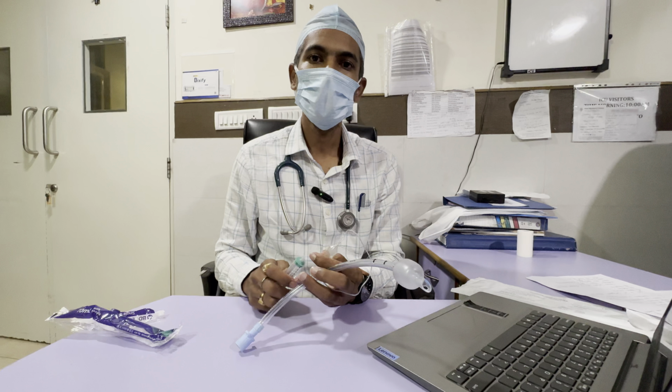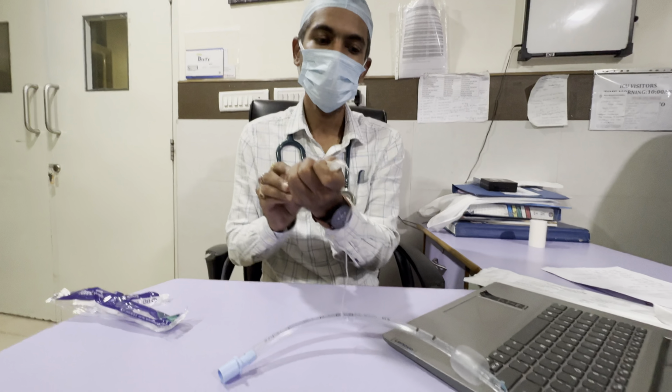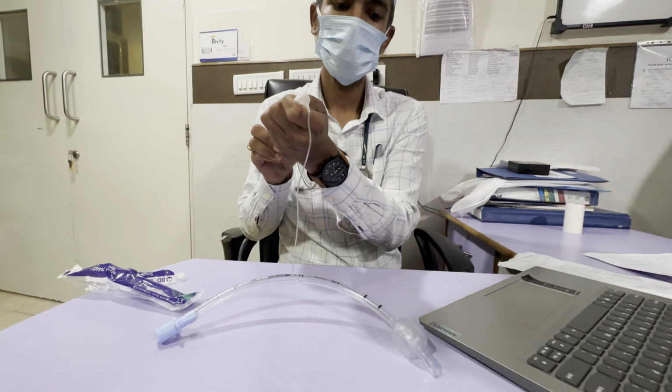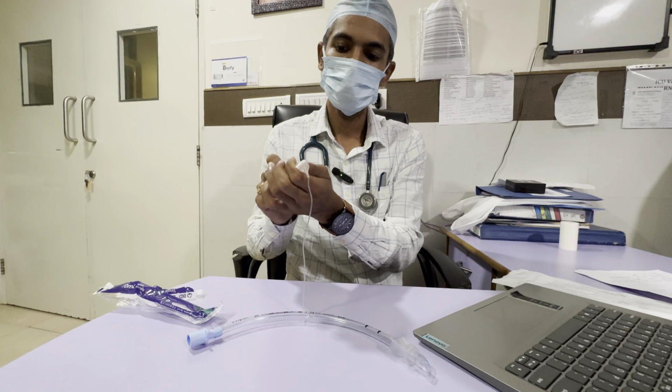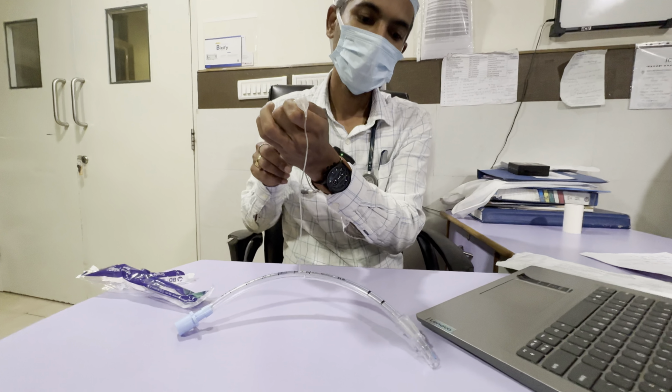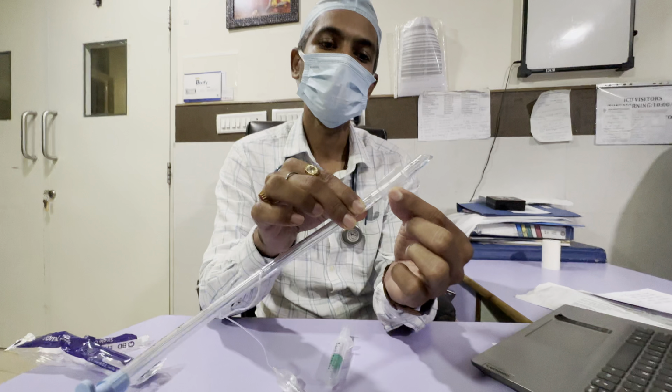Now I am going to show how to deflate the cuff. Just connect the syringe and draw the air. You can see here the cuff is deflated.